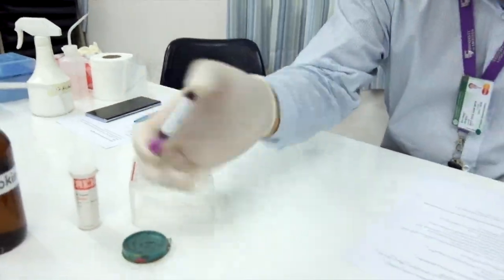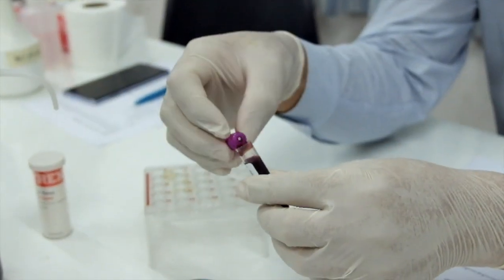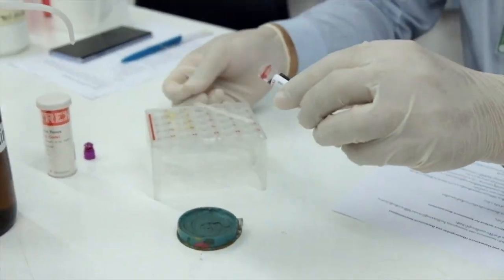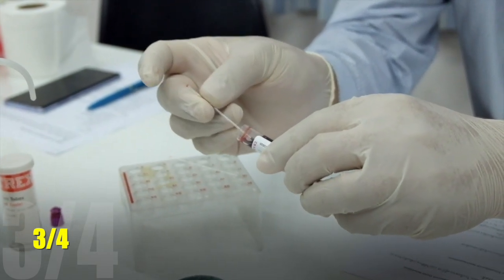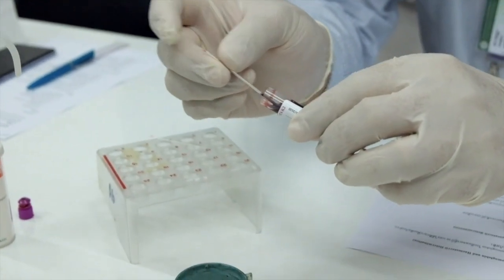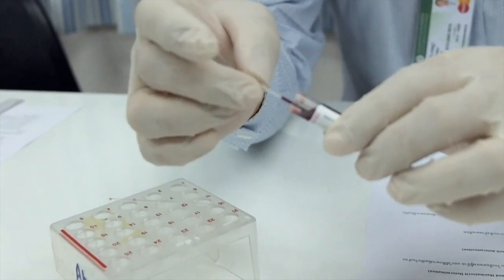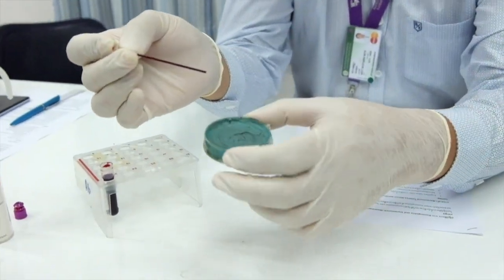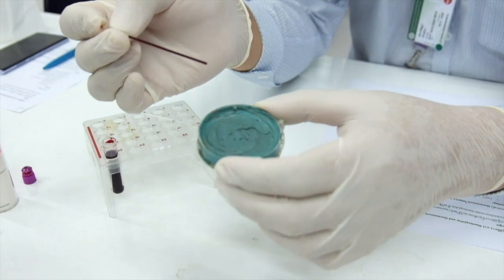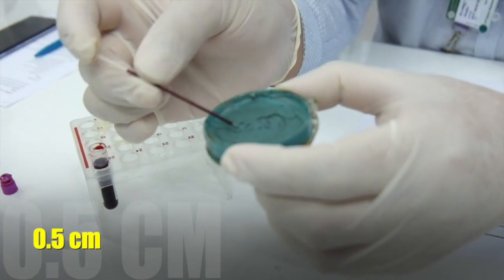Mix the unknown blood sample and tilt the collection tube to get through the blood easily. Fill capillary tubes with the blood up to 3/4 in both of the tubes. Seal the end of the tube with the oil-based clay by pressing the tube into the top and allow the clay to plug in for about a half centimeter in its length.